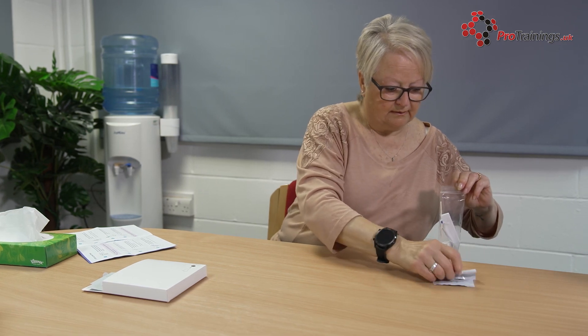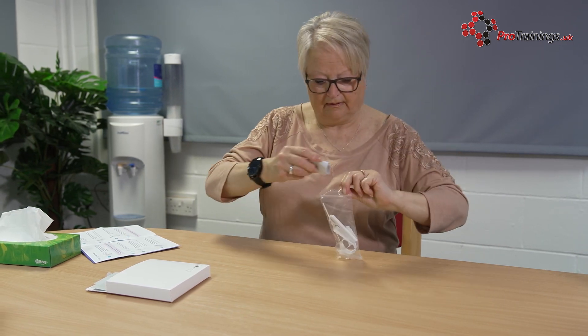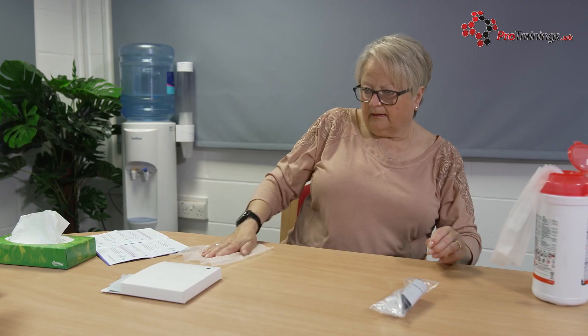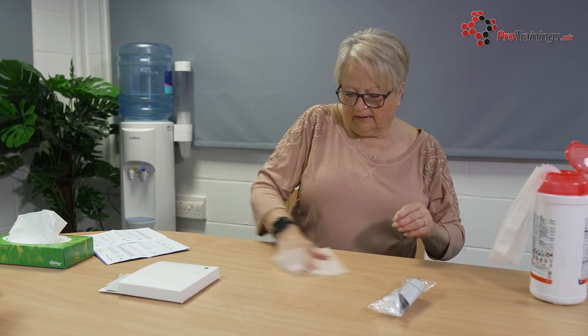With this UK test, you will also need to report your results, whether they are positive or negative. You can do this online or by phone using the QR code or the product ID number printed on your test strip.